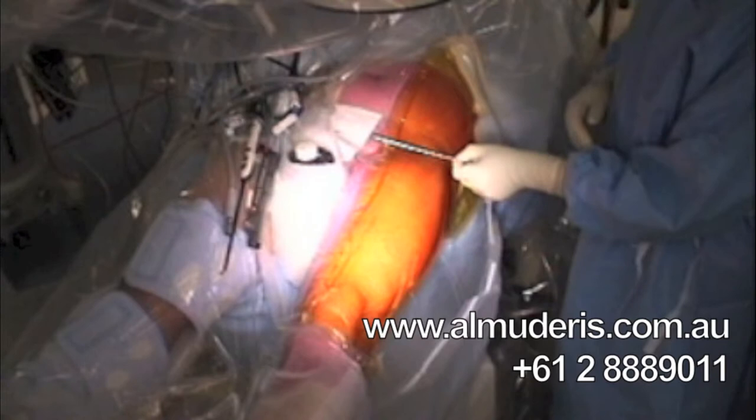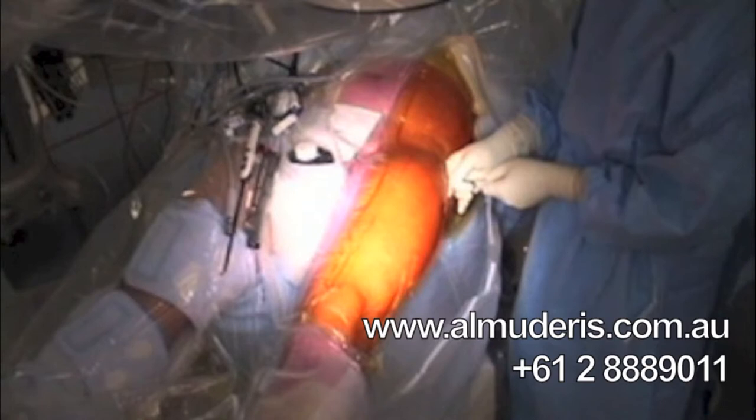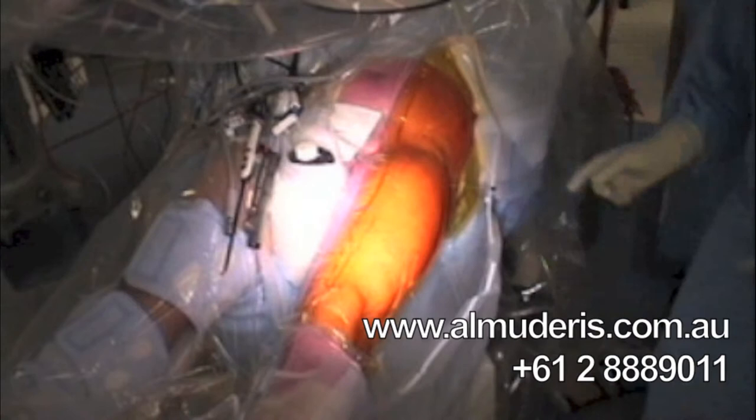X-ray, save this one. Through a small needle entry point, X-ray. My needle, as you can see, is skiving off the femoral neck, so I'm very happy with this position. This technique allows us to have access to the hip joint without any risk of damaging the cartilage.